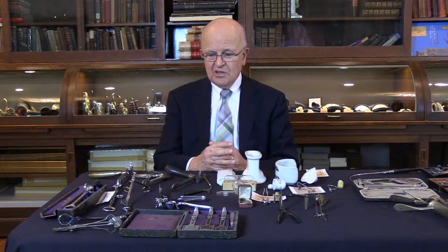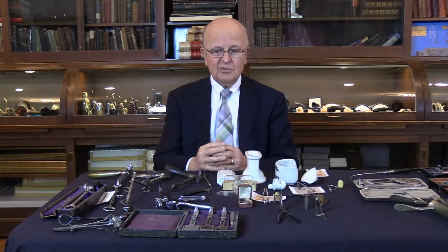The popular instrument to remove the tonsils in the past was the guillotine. As a matter of fact, when I moved to Huntington, West Virginia, there was an older otolaryngologist, and I was telling him that I have a guillotine. He said, well, I still use it, and he showed me how he does the tonsillectomy.